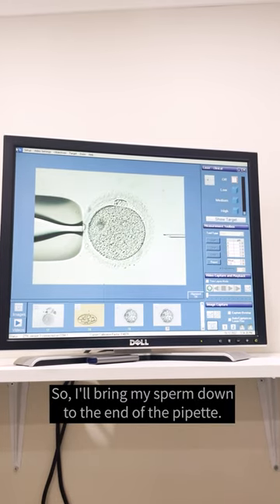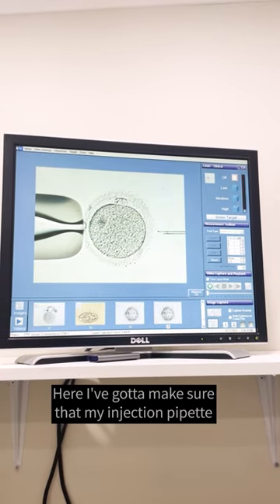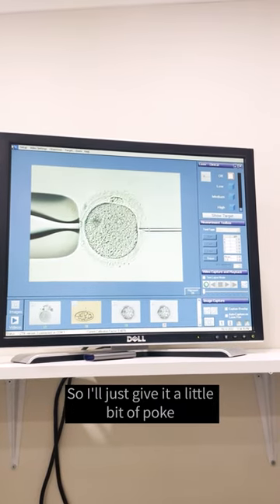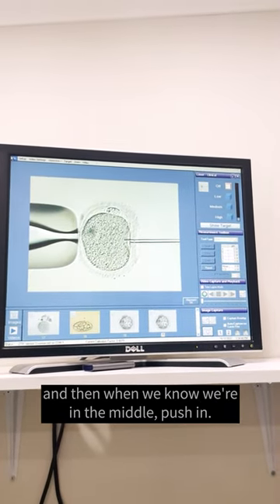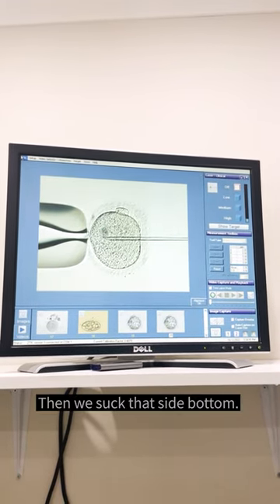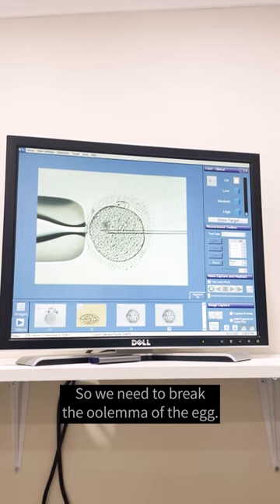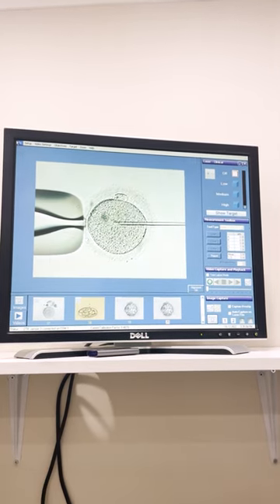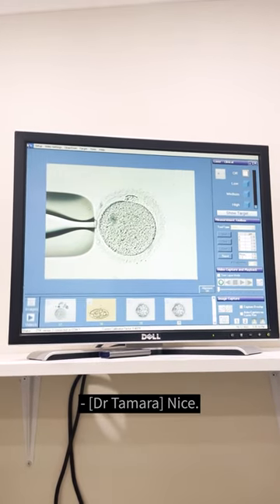So I bring my sperm down to the end of the pipette. We're going to make sure that the injection pipette is actually in the right plane — we want to be injecting in the middle of the egg. So I'll just give it a little poke. When we know we're in the middle, we start to aspirate back. So we need to break the oolemma of the egg — that's the thin membrane around the egg. There it goes — sperm's in, and the fluid is removed. Nice, that's good.